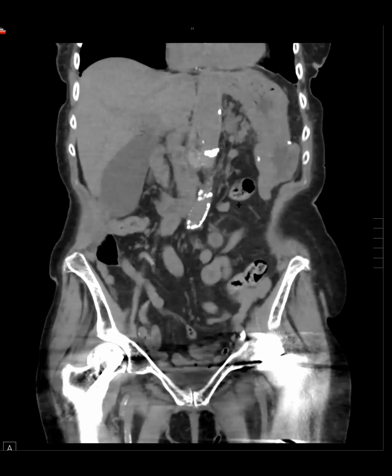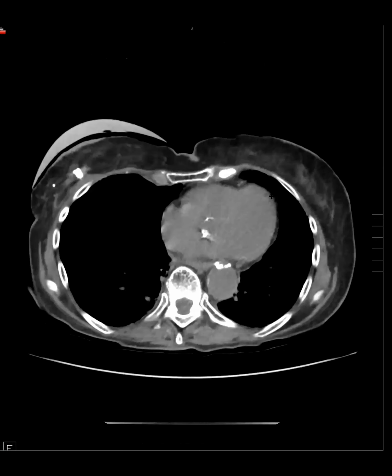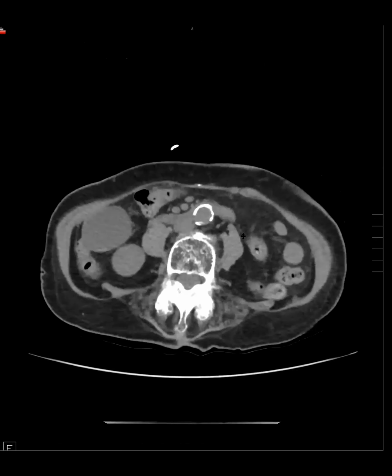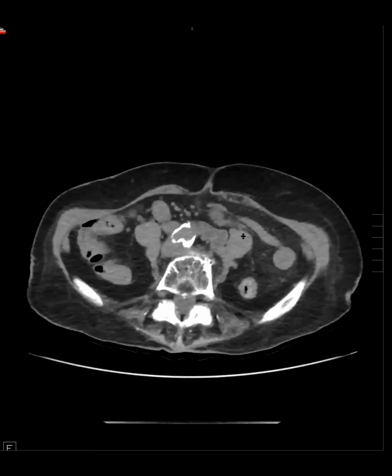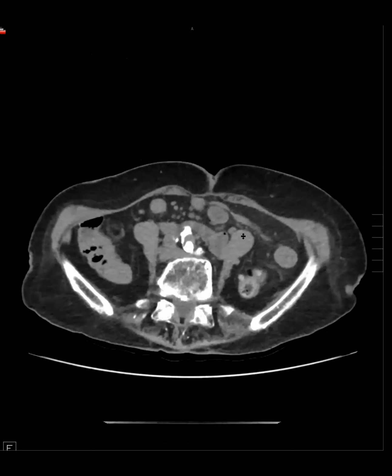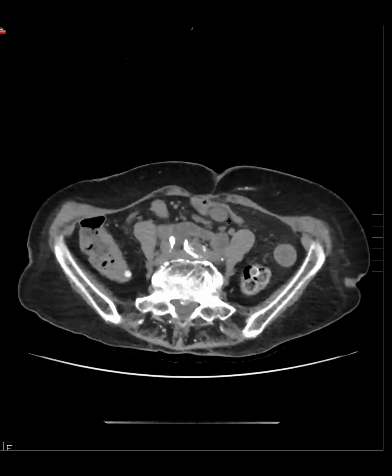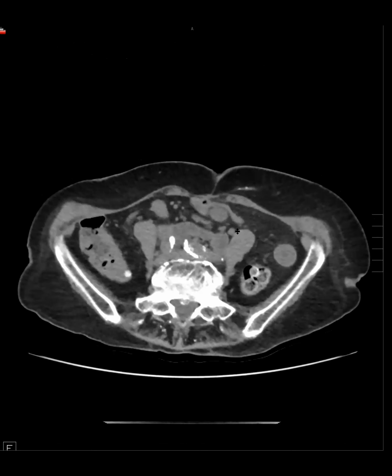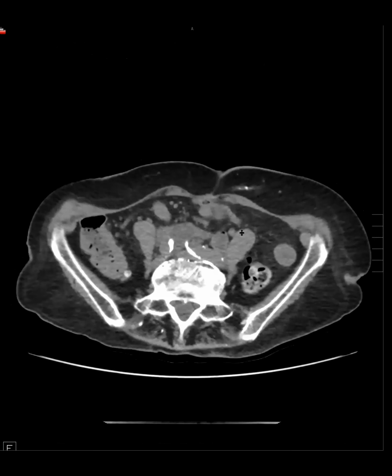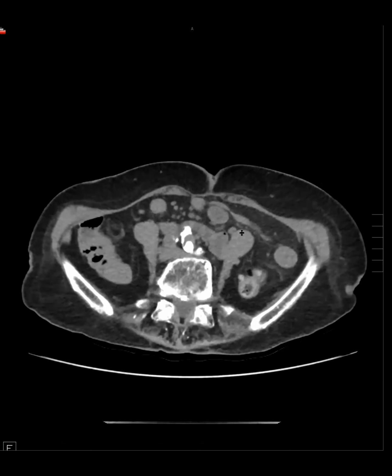Yeah, I completely agree. And this patient doesn't have a lot of fat either. I know from the literature, if the BMI is greater than 24, peritoneal findings are, I mean, you don't need oral contrast. This patient doesn't look like they have a BMI of 24. In patients with BMI less than 24, I know we typically advocate for positive oral contrast, in addition to patients with a malignant history.